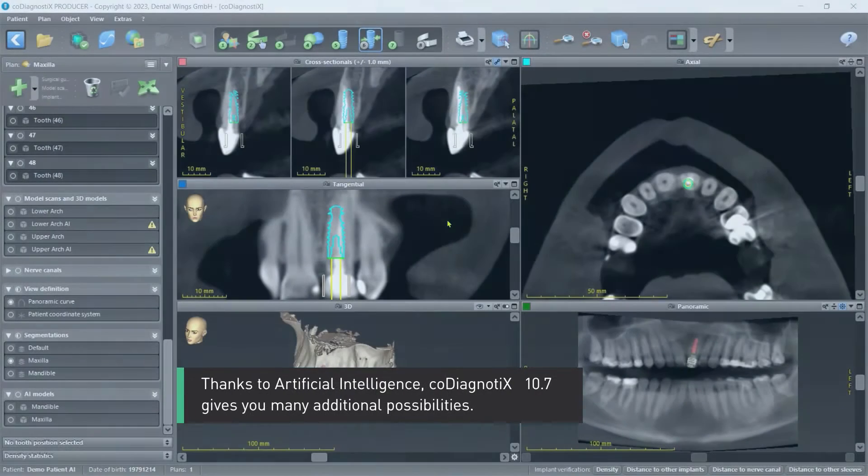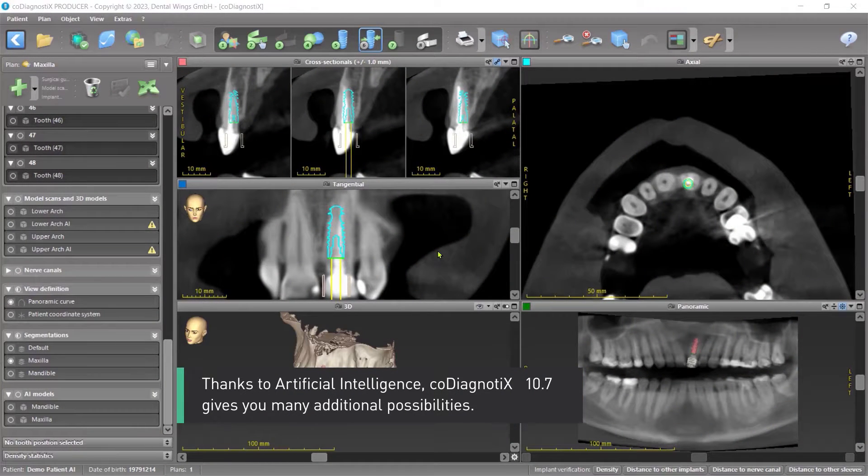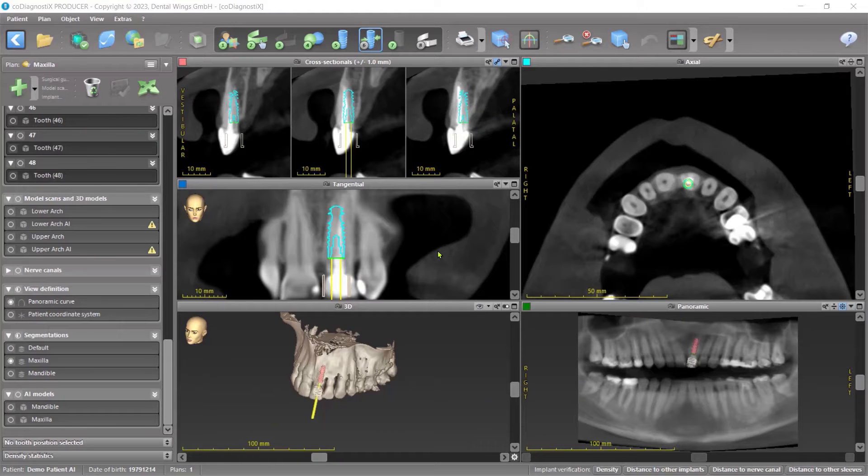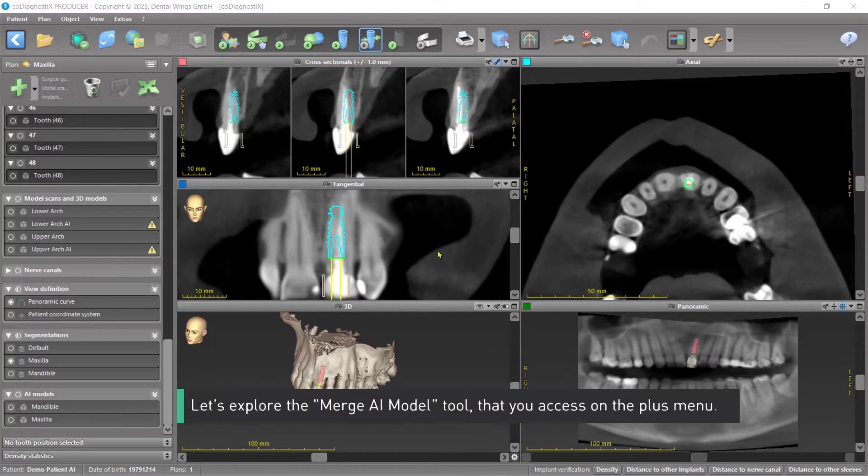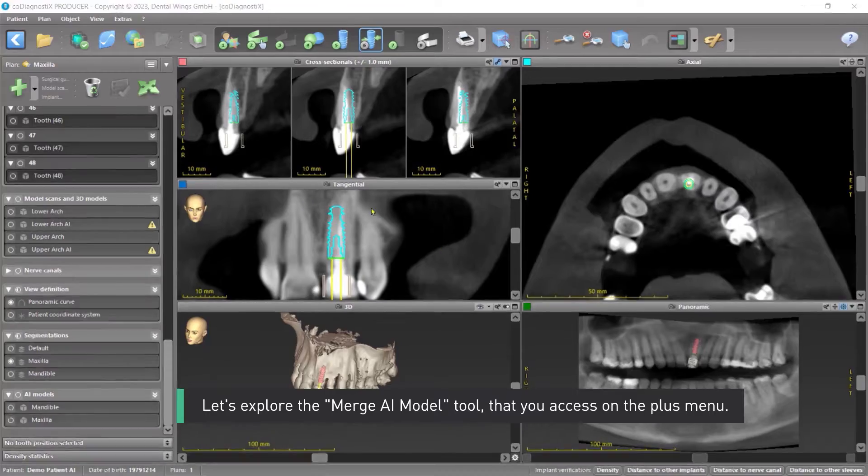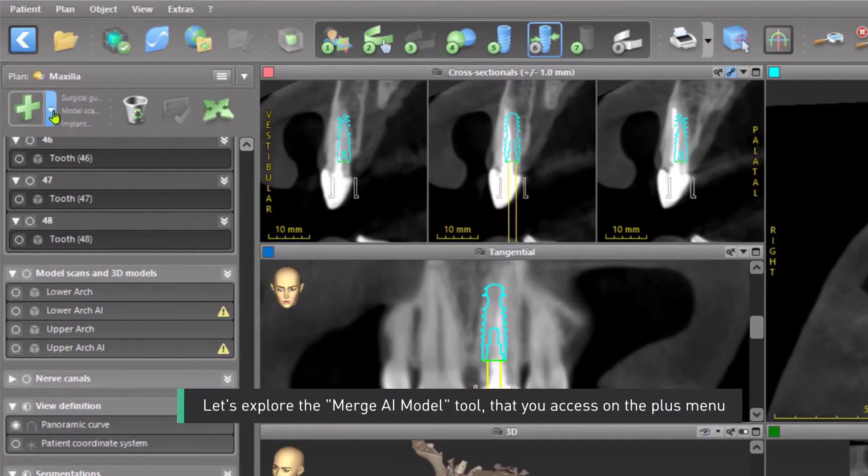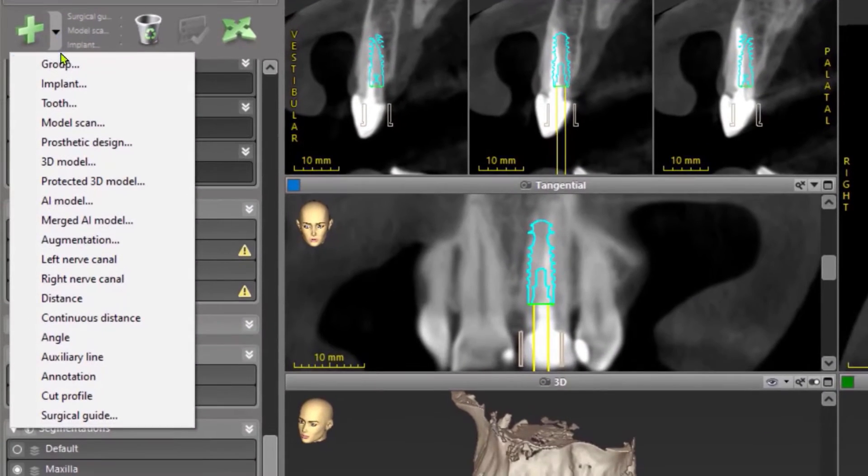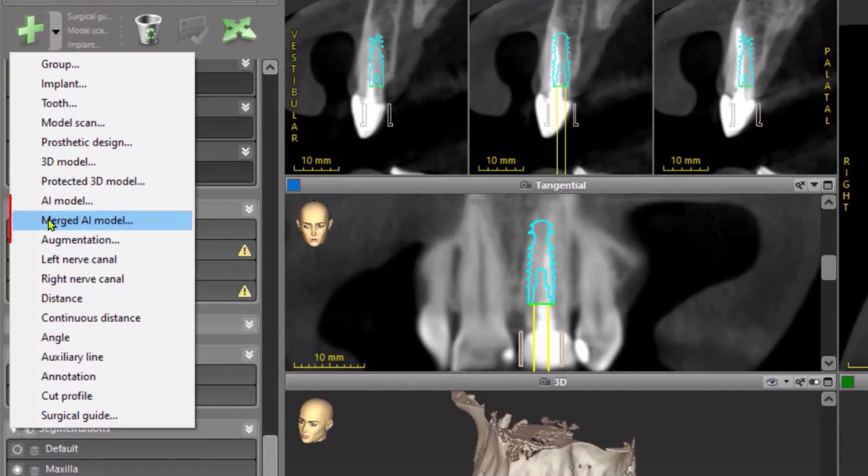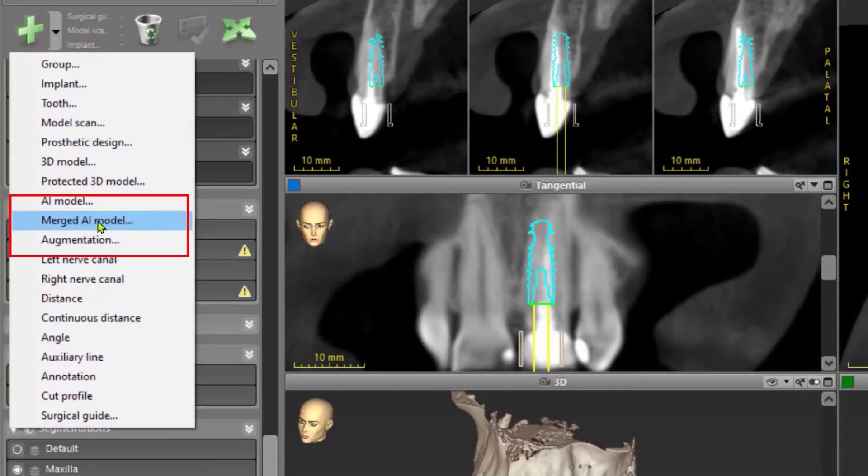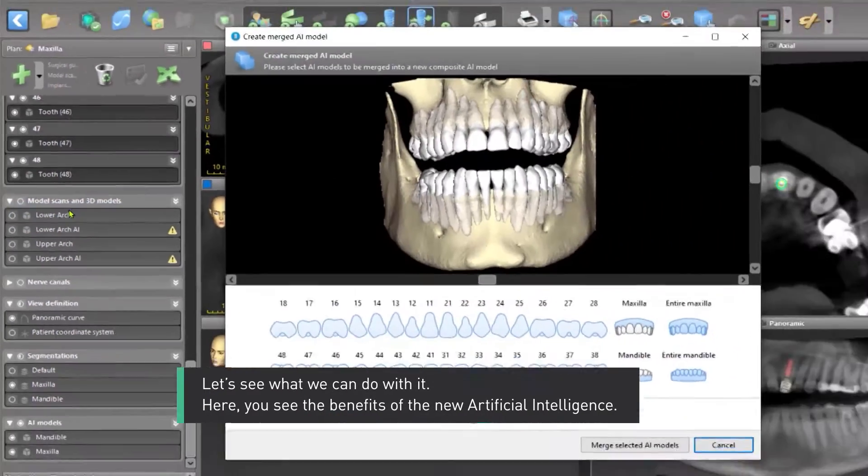Thanks to Artificial Intelligence, CoDiagnostics 10.7 gives you many additional possibilities. Let's explore the merged AI model tool that you access on the plus menu. Let's see what we can do with it.